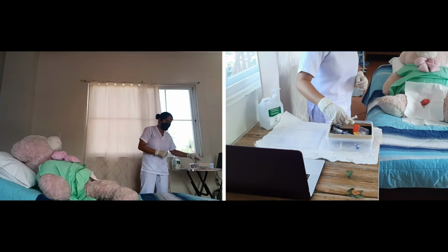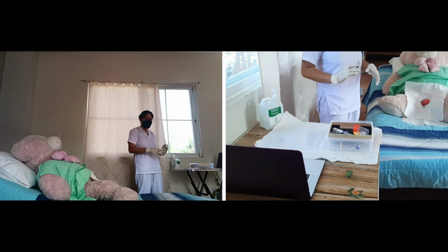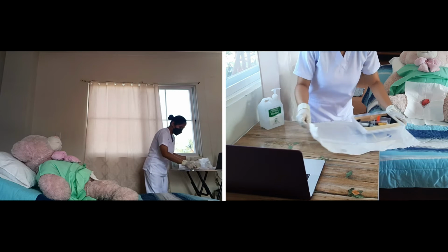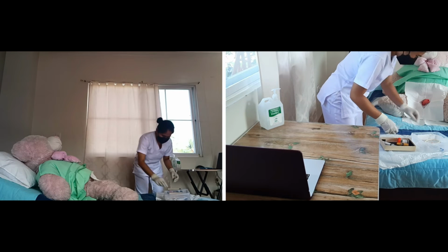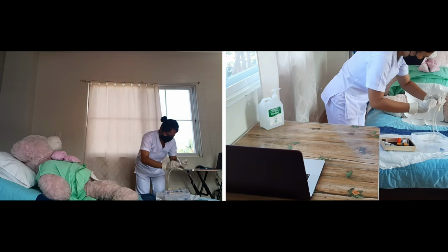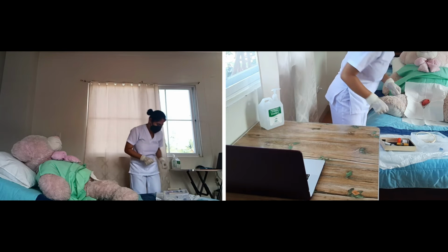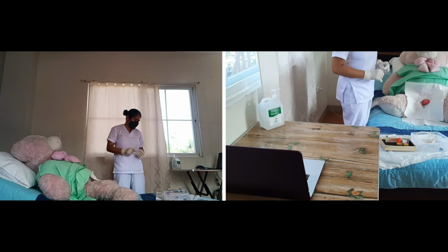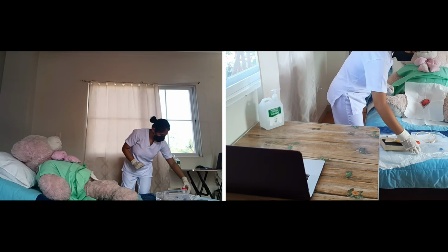Okay. And this is the 10 cc of sterile water, which is supposed to be attached to the balloon port. So let's do that. Just really making sure that it is attached very well. So let me move it here first. This is the sterile lubricant we're going to be using later. And finally, our antiseptic solutions, which are the cotton balls and sterile forceps. With these two, I'm not going to be using.